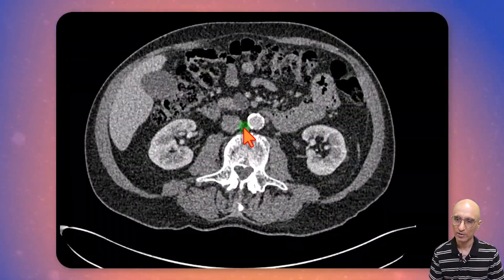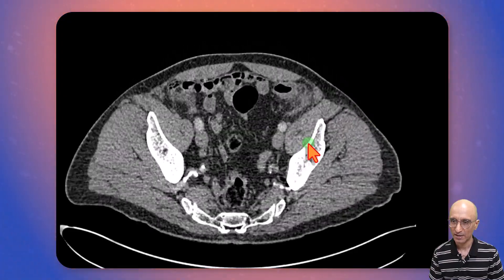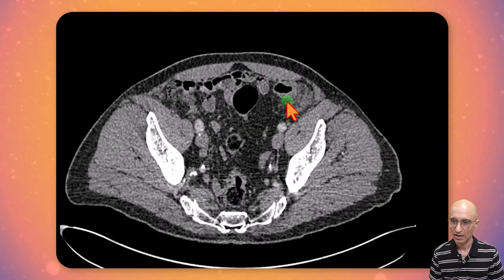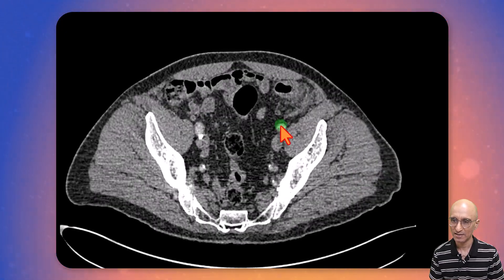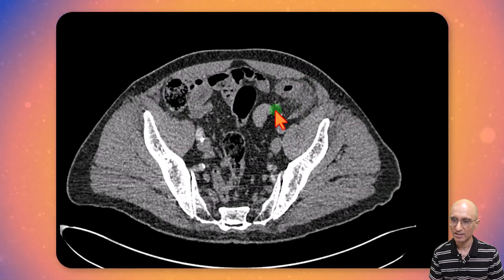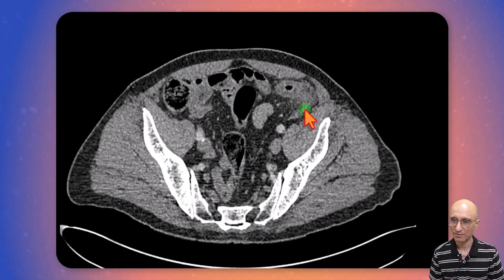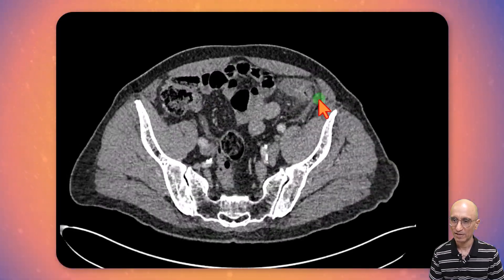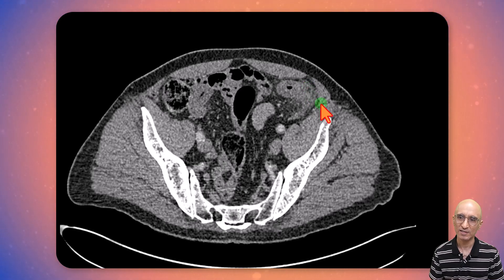As you scroll through the CT images, we can see the patient has multiple colonic diverticula in the left lower quadrant, which was the patient's symptomatic site. We can see a thickened loop of the descending colon with an inflamed diverticulum. There is pericolonic inflammatory fat stranding without perforation or collection. Imaging appearances are consistent with acute diverticulitis.